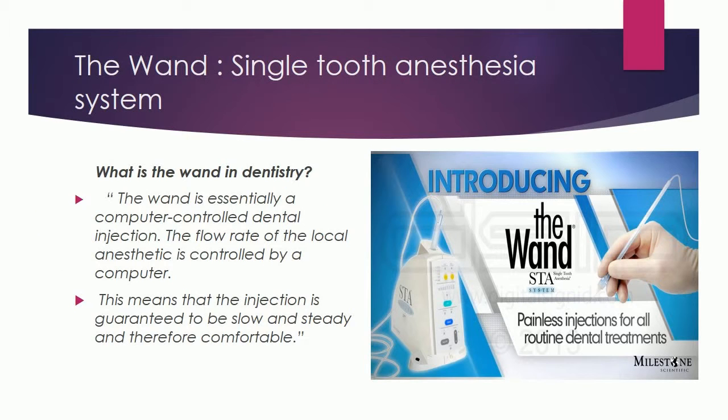The Wand, Single Tooth Anesthesia System. What is the wand in dentistry? The wand is essentially a computer-controlled dental injection. The flow rate of the local anesthetic is controlled by a computer. This means that the injection is guaranteed to be slow and steady and therefore comfortable.